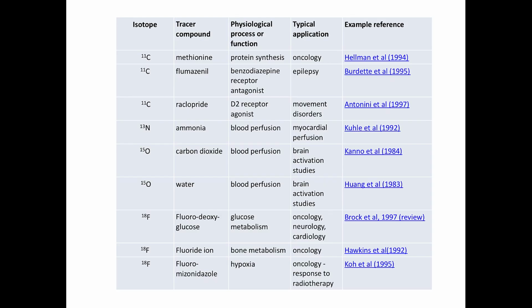All right, now up to now, what we've talked about with PET is FDG PET, so imaging this fluorodeoxyglucose, but we should note that PET is not just FDG PET. You can use other compounds and other isotopes as well for other biological processes. So here are some examples that are used in oncology and also other studies outside of oncology. And so you can see a wide range of different tracer compounds. Also, you'll see the isotopes are different: carbon-11, oxygen-15, F-18, in different ways.